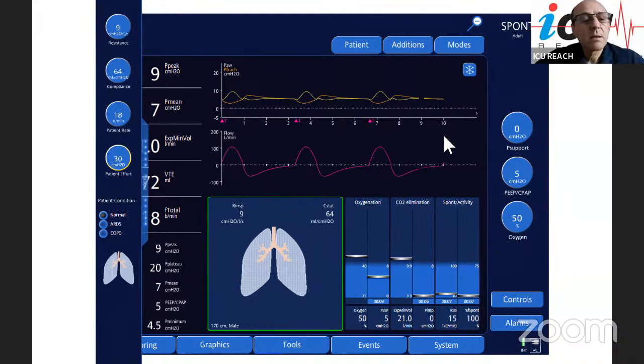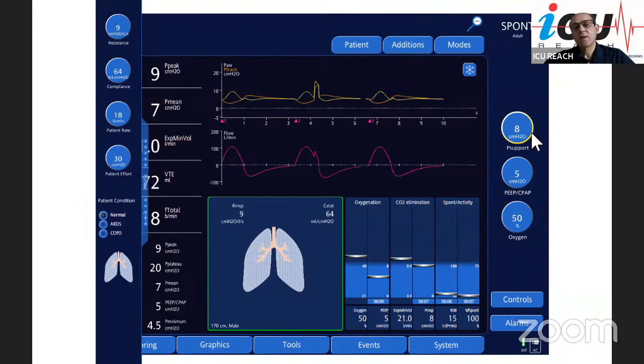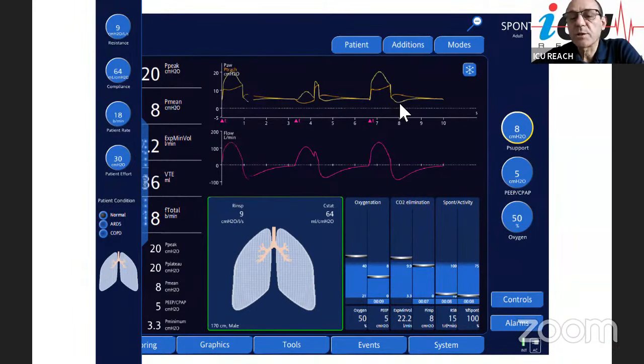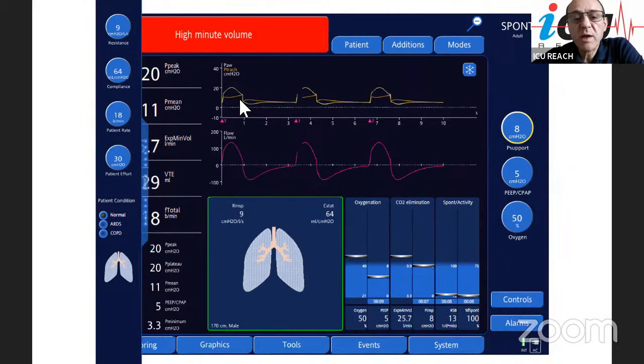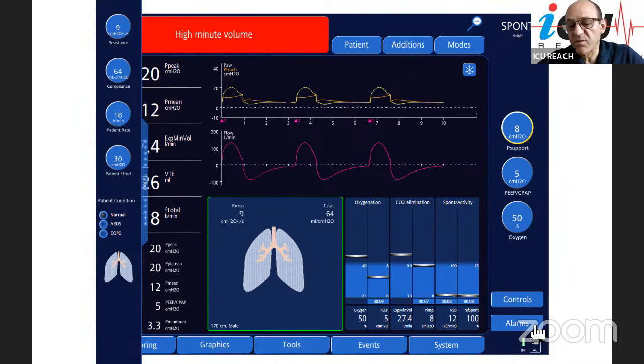And if you go back again to pressure support, if you do pressure support of 8, I just wanted you to see the decrease in the pressure. You can see here, I have pressure support of 8, and I have ATC above that pressure support. You can see that everything here is ATC. But look how clearly you can see that the drop in the pressure is not only in inspiration, but is also, let me take off the alarm.